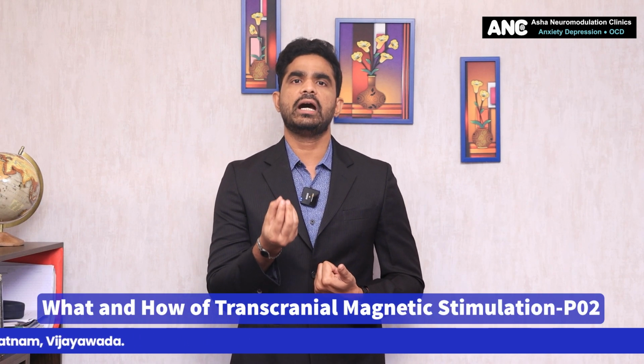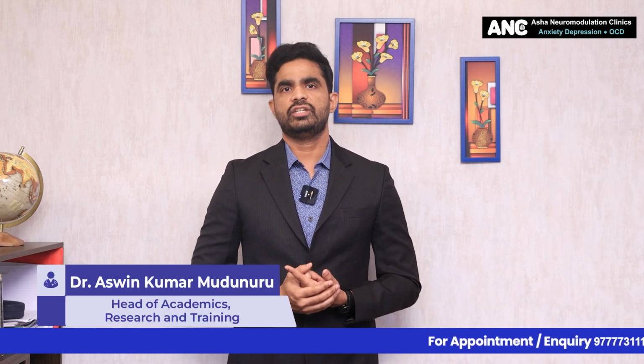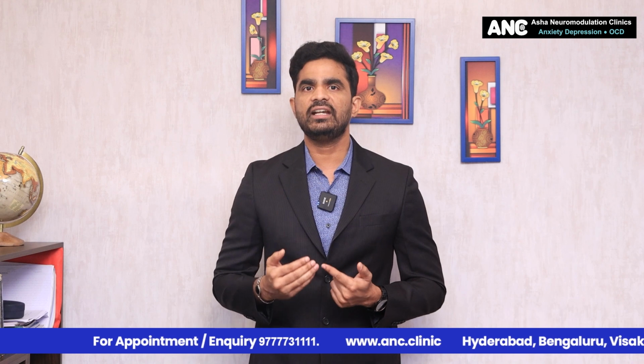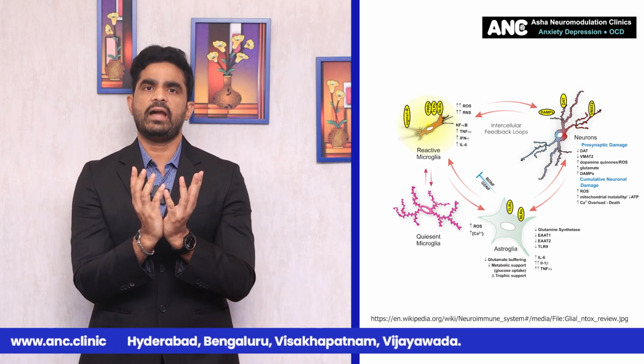What is the possibility? Number one, the magnetic field directly can have magnetic spin effects on certain proteins inside the neurons or certain DNA or RNA material inside the neurons. Number two, magnetoreception by the genetic apparatus. The genes are susceptible to the magnetic field and hence they can open or close. What you call genetic expression can change. Number three, neuroprotection. The neurons are protected from external factors by the glial cells, and these protection mechanisms are enhanced by the effect of the magnetic field.